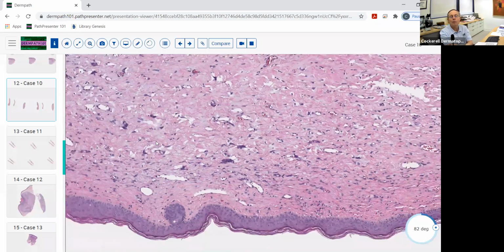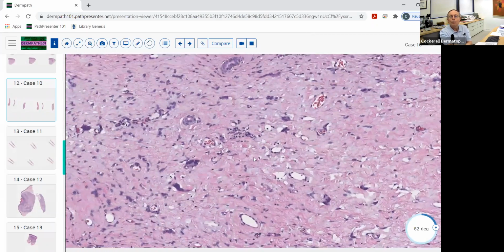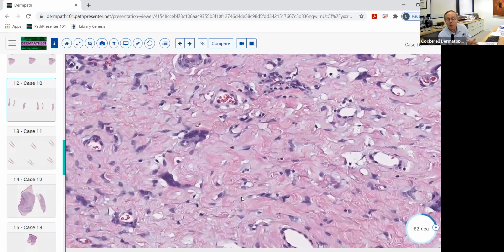So pleomorphic fibroma. And there are several different so-called pleomorphic tumors, if you will, that we see in dermatopathology. You have pleomorphic leiomyomas. You get pleomorphic angiofibromas, fibrous papules. You can see some of these pleomorphic cells in there. You get this pleomorphic lipoma, where you see these same types of cells in here. So there's about 5 or 6 entities that give you these very classic multinucleated, large pleomorphic fibroblast cells within them. And it's sort of a family, if you will. It's benign. It's not cancerous.